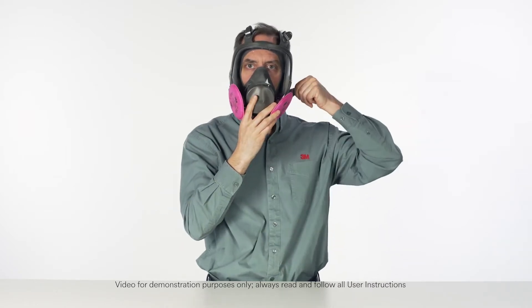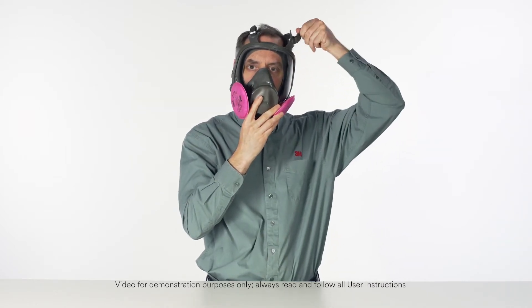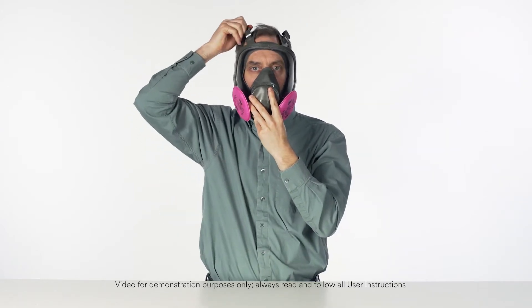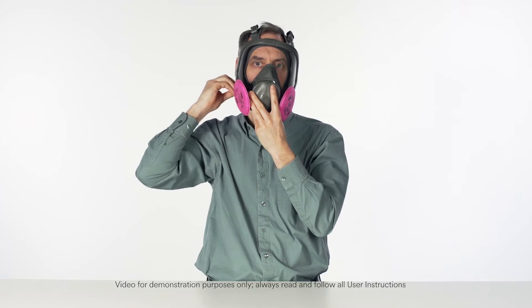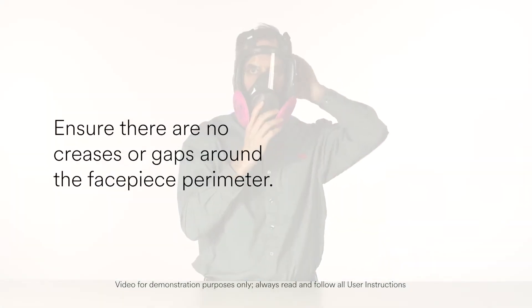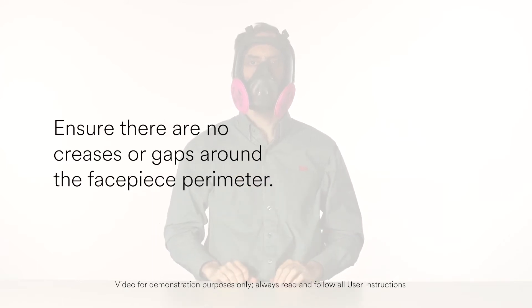Tighten the two bottom straps, then tighten the two top straps. Adjust straps as necessary and make sure the back of the harness is centered on the back of your head. Ensure there are no creases or gaps around the facepiece perimeter.